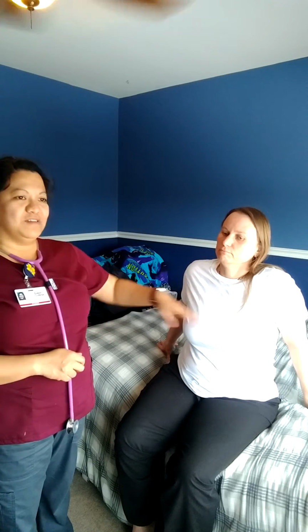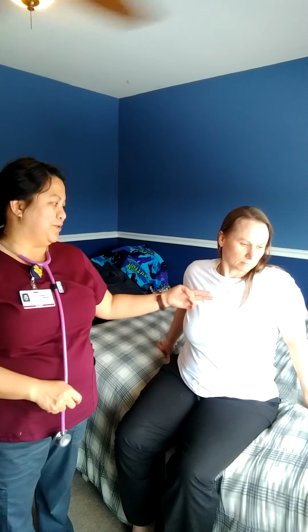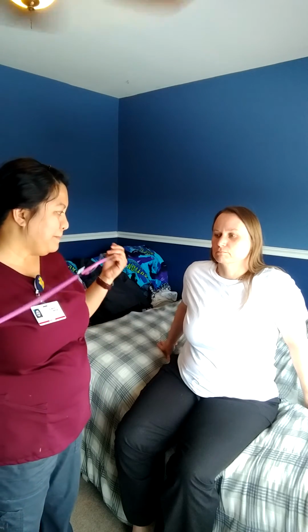The S2 is louder on the aortic and pulmonic location, and the S1 is louder on the tricuspid and the mitral location. I did not hear any abnormal sounds like murmur.